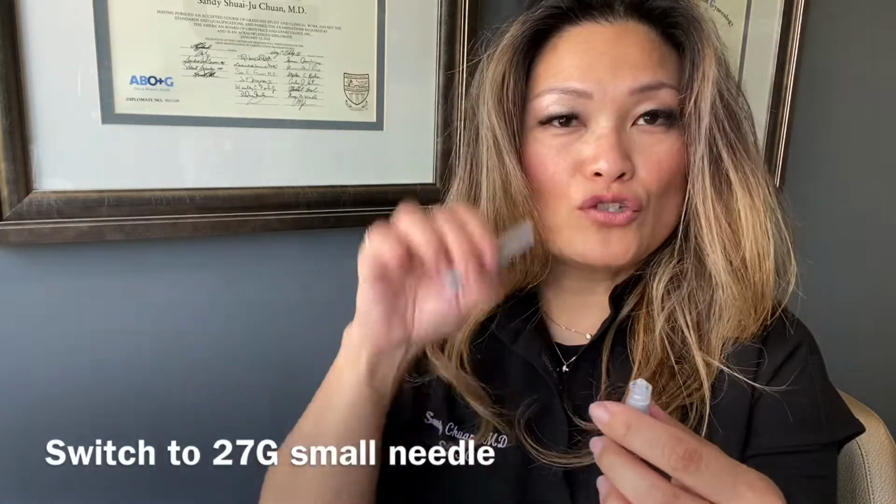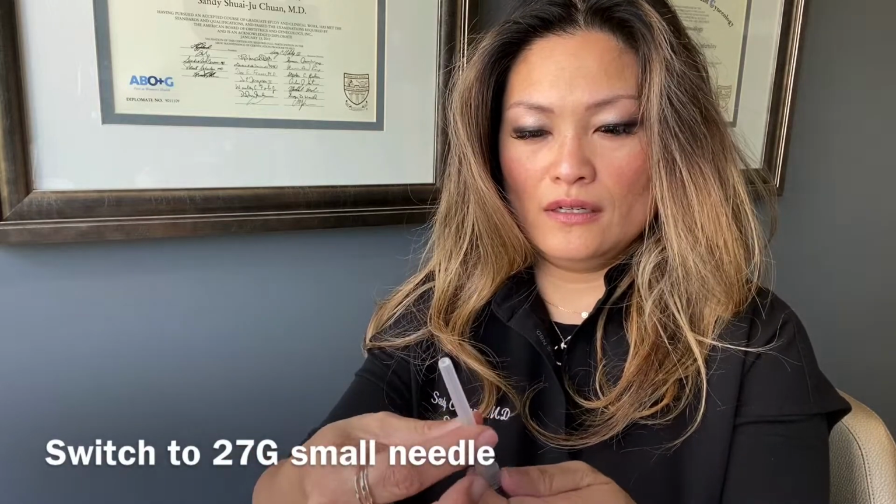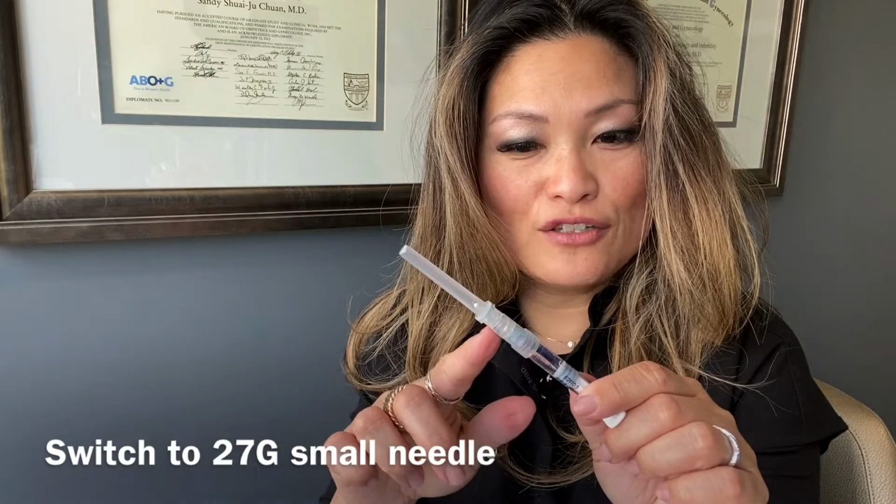So then once you have all of your medication, you will have to, unfortunately, cap this back on, twist this off, and you're going to get rid of this needle. Put it into your sharps container, and then switch to your little needle for your injection. Okay, now that's ready to be injected.